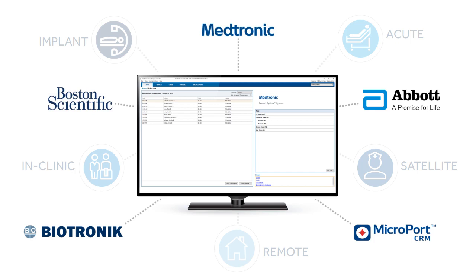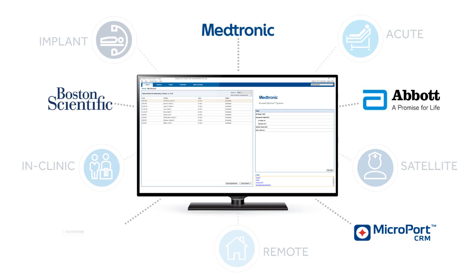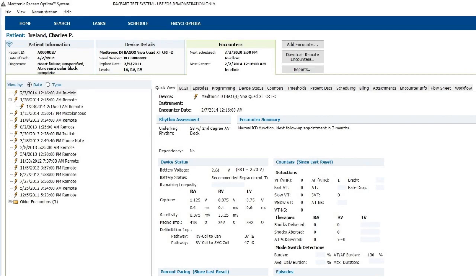Boston Scientific, Abbott, Biotronik, or Microport CRM, the data can be consumed by PaceArt and displayed in a simple, consistent format.